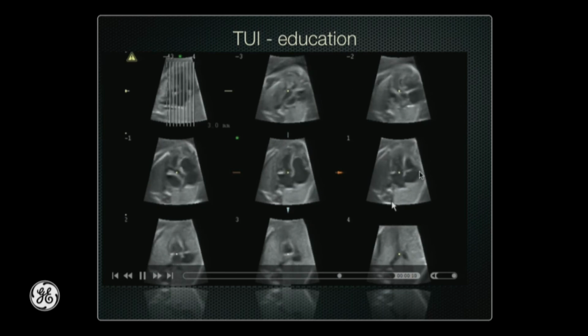But we are able to get images which show us a nearly normal four-chamber view, or maybe a beginner will think this is a normal four-chamber view. And you must be aware this is the annulus fibrosus. You have an oblique view of the four-chamber view, and using volume ultrasound, and I will show you later the same volume of this case, you will understand how important this is.